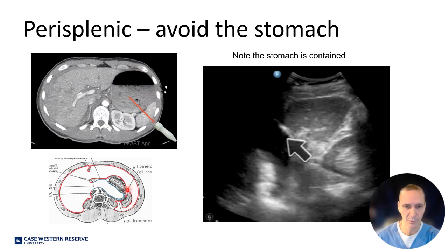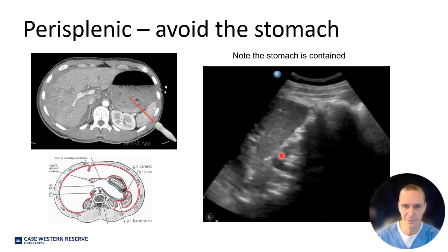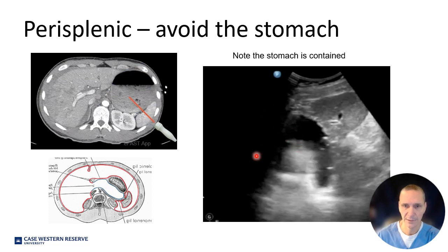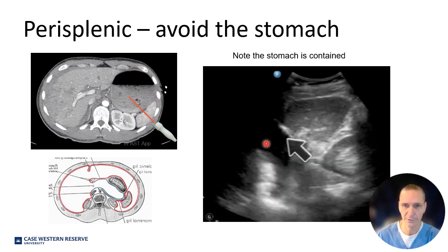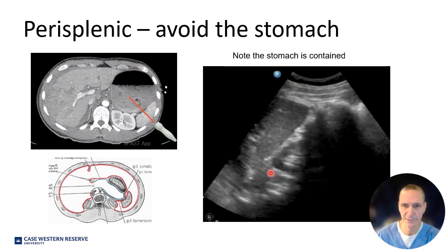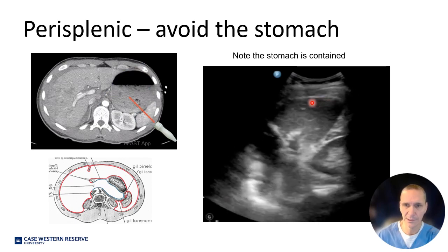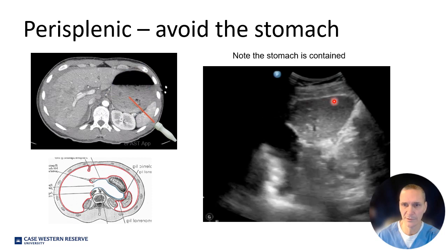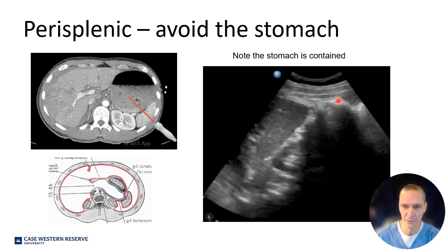And also beware here again, you don't want to catch the stomach. So this is stomach contents here, and that can be confused by early learners as hemorrhage, when in fact it's not hemorrhage. So bleeding, we'll show images of this. Bleeding would be in this area here, most likely.